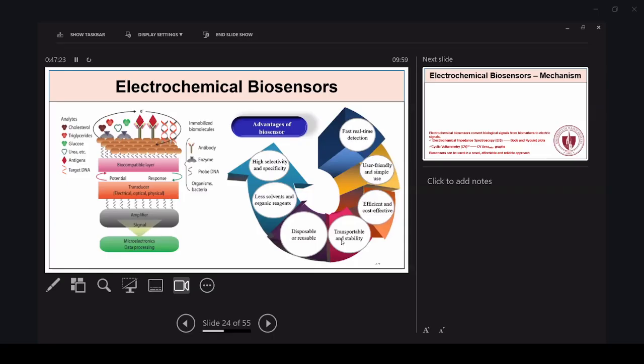You can imagine, right? It's just a chip, a normal chip. So what we thought is it should be similar to a pregnancy kit, right? A pregnancy kit is also a kind of microfluidic chip where you coat the HCG hormone and check for the positivity or negativity of the pregnancy hormone, right? So we wanted to develop that type of point of care device for cancer diagnostics.